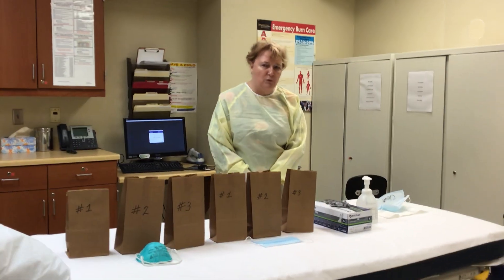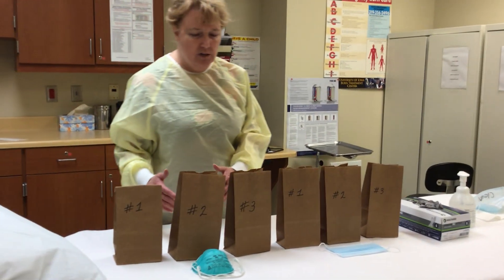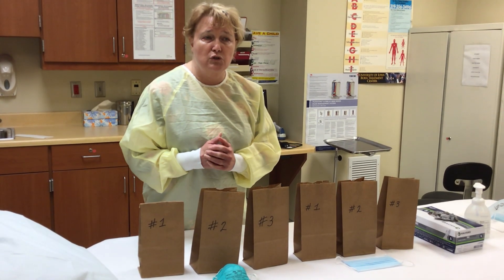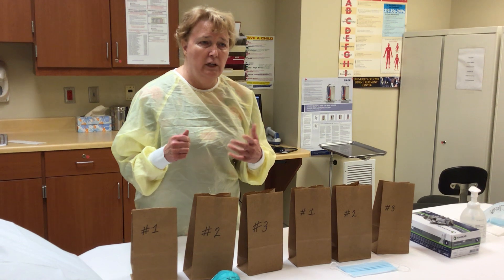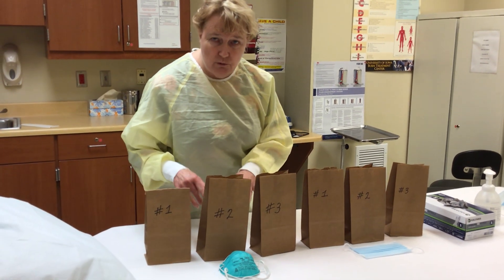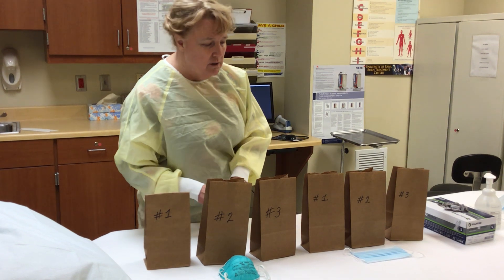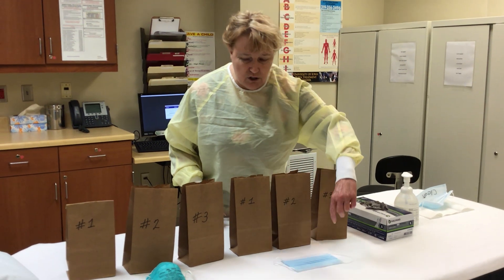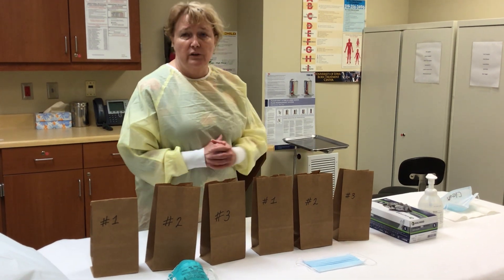We'll go over putting on masks first. Now some of you may get six bags of masks, and some of you may get three bags of masks. Those people who will be doing processes where they'll be exposed to secretions from people while they're swabbing or intubating or other things, they will get N95s. So you will get three N95s. If you don't already have them, speak to your leader — they will be getting you three N95s. Everybody should have three regular face masks. Some of you may have six bags, and some of you may have three bags. We'll go over the why of the three and three in a few minutes.